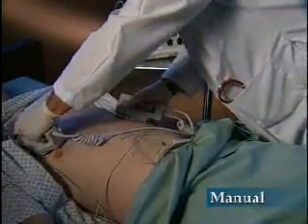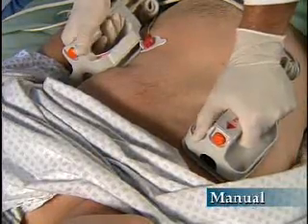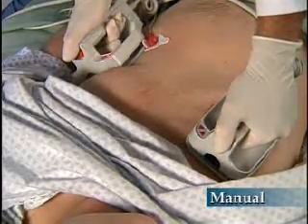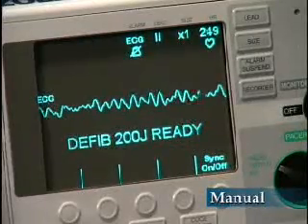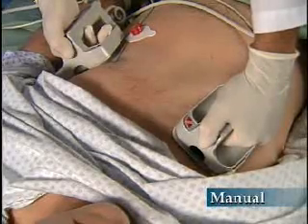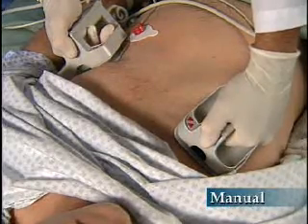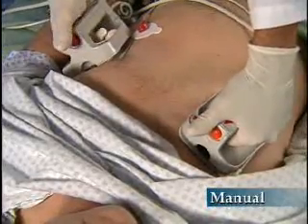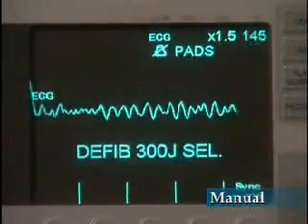Apply the paddles firmly to the chest and rub them against the skin to ensure good contact. After charging to the selected energy level, the charge indicator on the apex paddle will light. The charge-ready tone will sound, and the energy display will show READY and the selected energy level. Verify the energy level, warn all persons to stand clear prior to discharge, and observe all other safety procedures. Clear. Using your thumbs, depress and hold both shock buttons simultaneously until the energy is delivered to the patient. The display will show the amount of energy delivered.